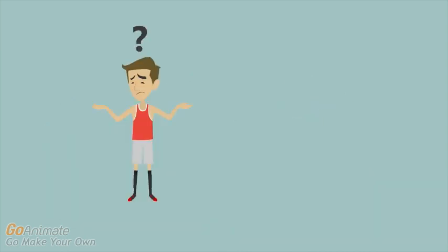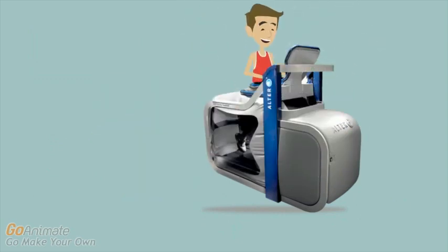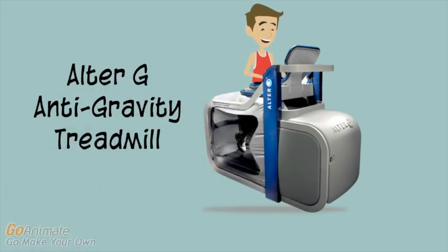A treadmill was developed that uses differential air pressure to unweight the lower body and allows for progressive loading. This technology was then licensed to Alter-G in 2005, and since then has been used to rehabilitate a wide range of patients.